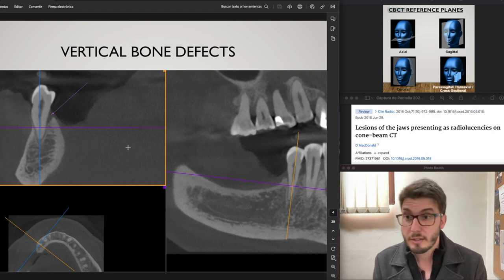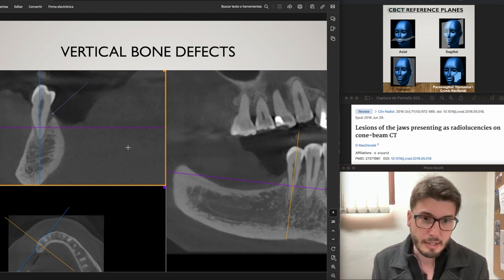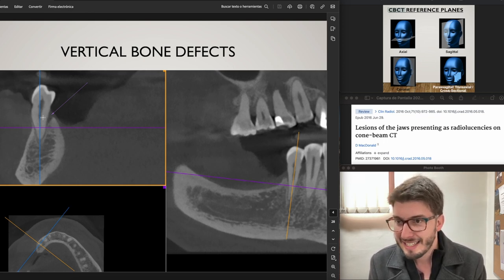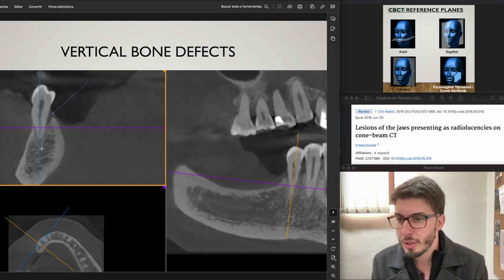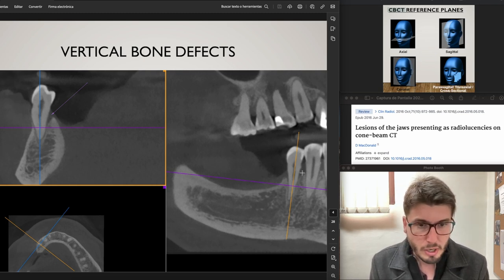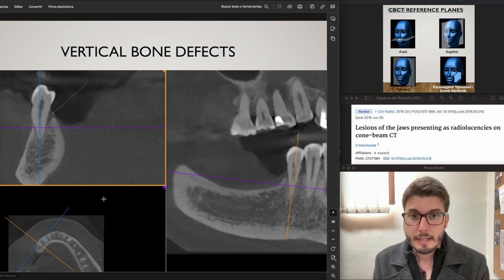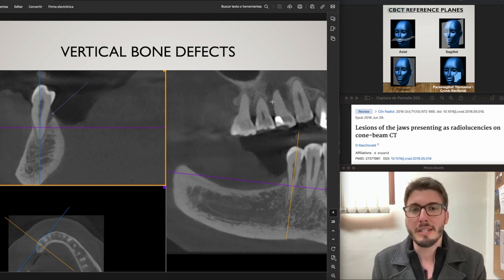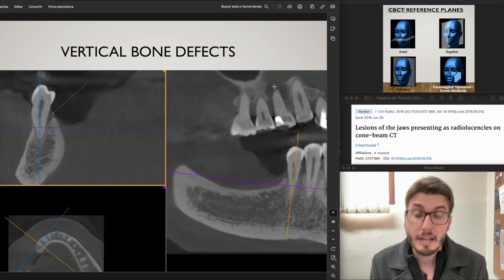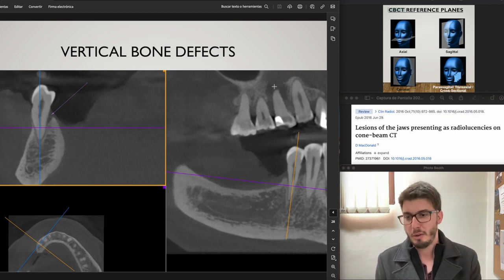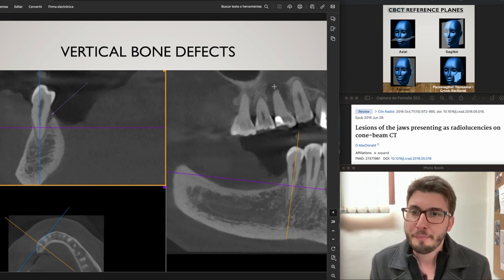Now we have vertical bone defects, including a lingual bone defect — not the most common situation, but diagnosable when our axis is completely parallel to the long axis of this tooth. Interproximal calculus is visible here, horizontal bone loss of the edentulous span, and even an endoperial lesion in the maxilla. We need to bring all the axes to the maxilla if we want to assess this region properly.